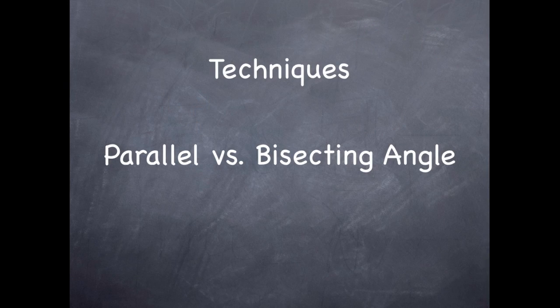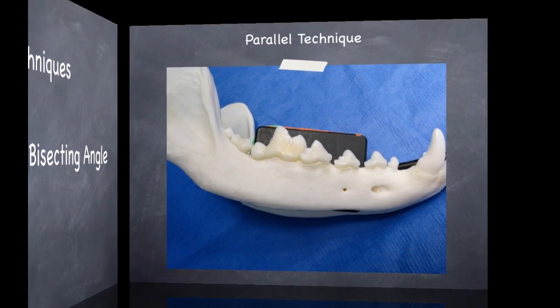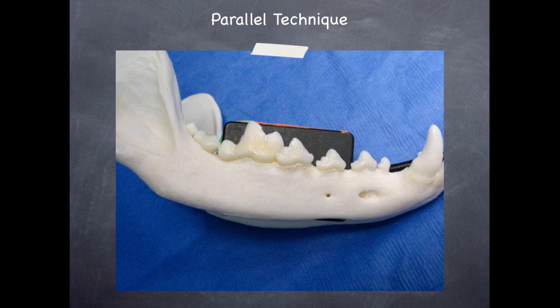The first technique that we're going to talk about is the parallel technique. And the good news is this is a very easy technique to master. It's very simple. We've got the sensor placed behind the tooth, and we take our beam or our tube head and aim it directly perpendicular to that sensor. So we're shooting through the tooth right onto that sensor.